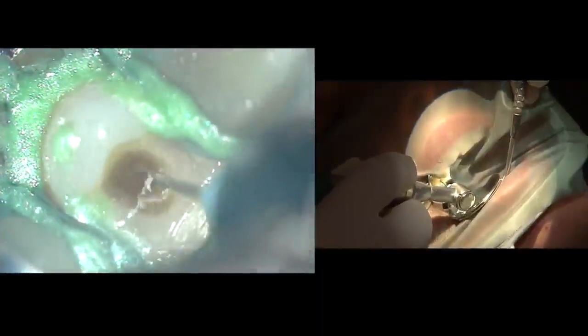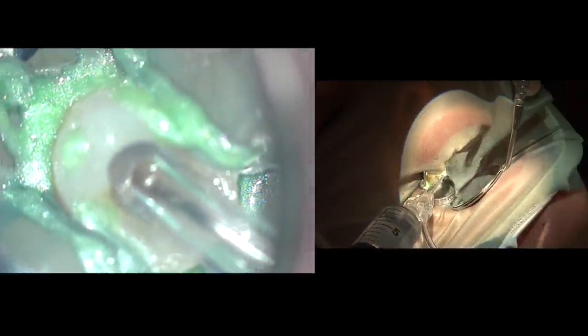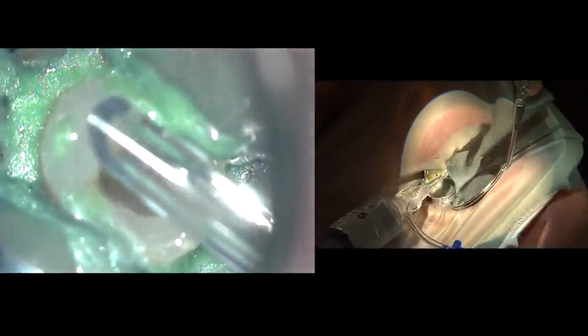M4 handpiece is used in crown-down motion with stainless steel files. We start with size 20. It will create a glide path. 10 to 15 seconds per canal in the brushing movement. We must not force the file in, just leave it where it goes. Indovac is then used to flush all the debris out. You can see here the vapors or the chemical reaction between sodium hypochlorite and the collagen and all the gas formation, and some debris coming out from the root canal.